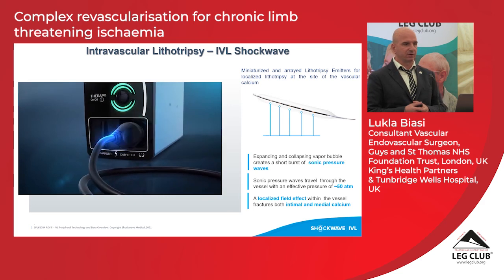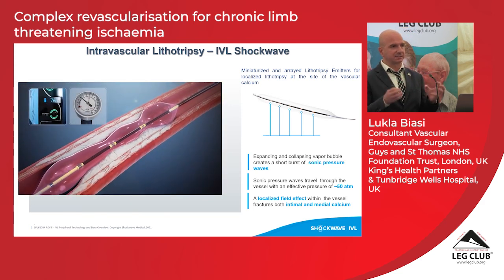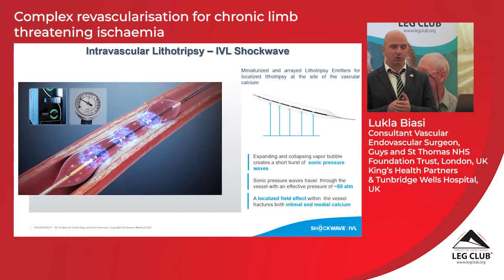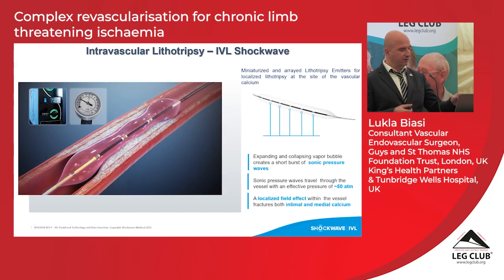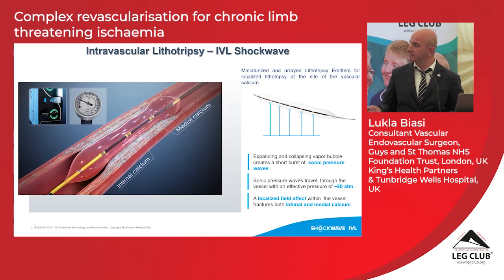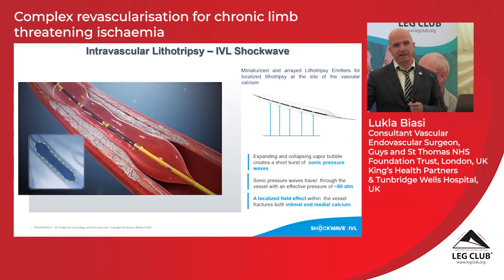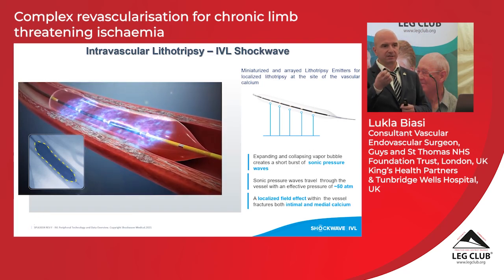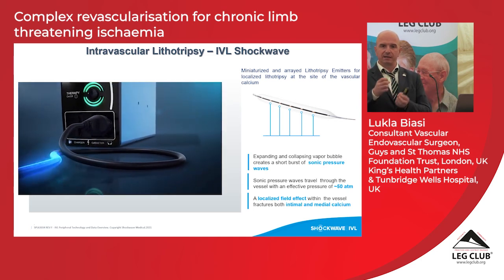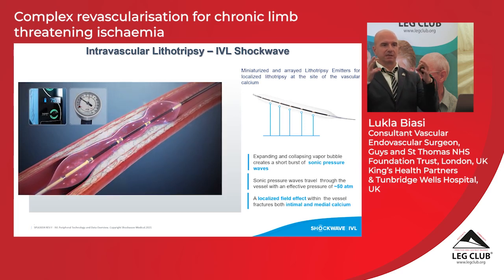It's lithotripsy. So it's an ultrasound-based technology that breaks down the calcifications in the same way that the calcium in the kidneys can be broken down. So we have a catheter with a balloon, and inside the balloon there are emitters that are producing a sonic wave. The whole catheter is connected to a plug. There is an electric impulse. The electric impulse is transformed into a bubble wave that produces a sonic wave.